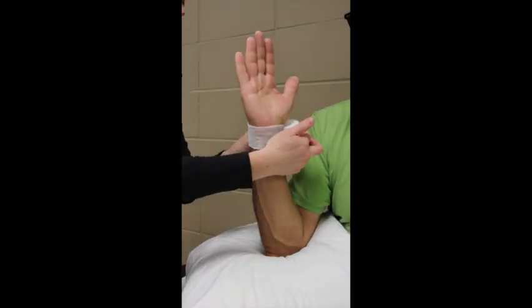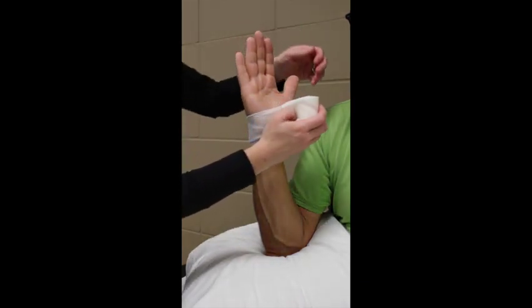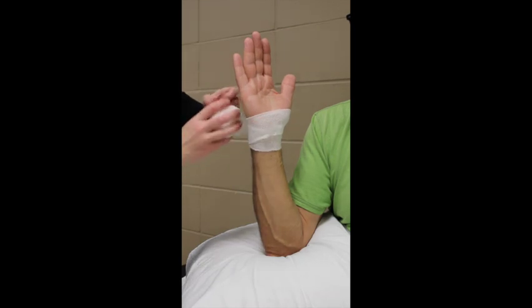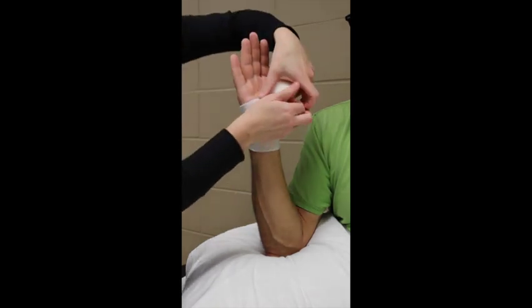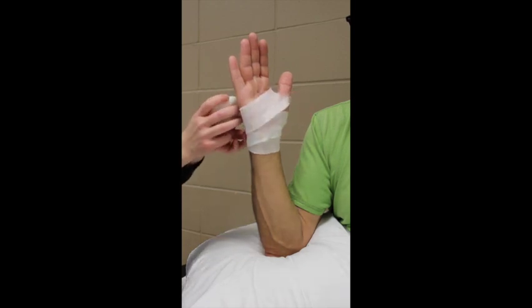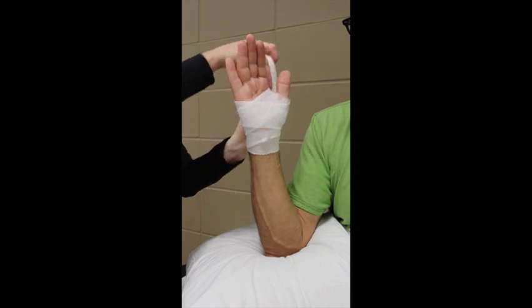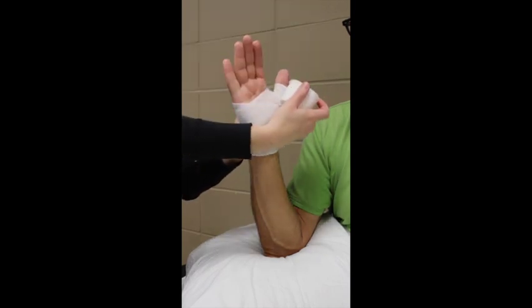Start by wrapping the padding around the wrist — this provides a place to anchor the padding before working around the hand and thumb. Working your way up towards the hand, go through the first web space by tearing the cast padding, then come around the hand and up around the thumb.